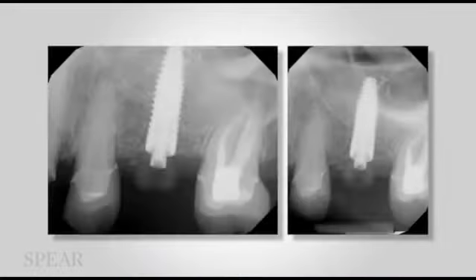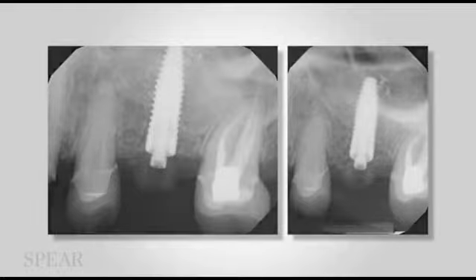So at the end of the day, with the sinus lift and bone grafting and a little soft tissue augmentation, there's no surprises. We knew exactly what we were going to do. So the implant was placed exactly where it needed to be placed for us, and we handled that part of the biology because we knew what the structure and function were going to be and the aesthetics.